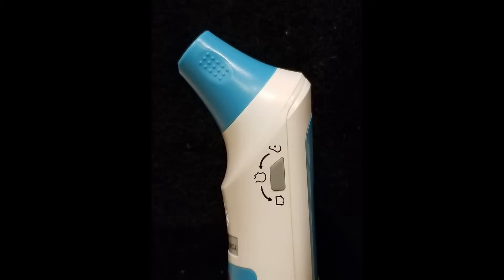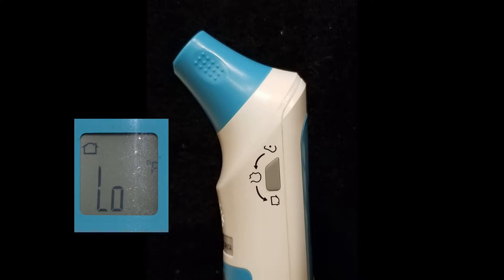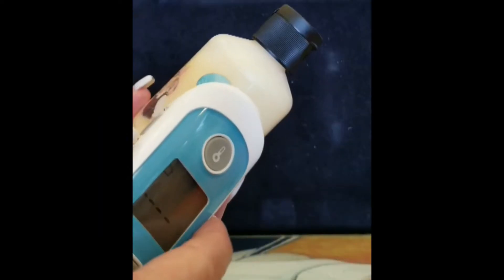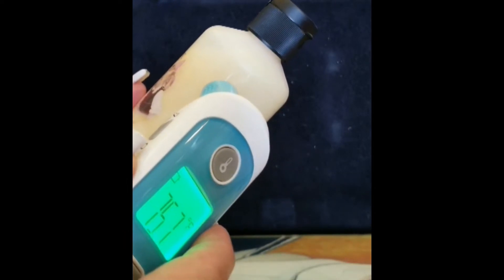Now if you want to take your temperature from your forehead, just put the cap back on — it snaps on very simply. Remember to press this button so you can see the forehead icon on the LED screen. Put this up to your forehead, press the button, and there it is — ninety-seven point seven. If you want to measure an object, press the button until you see the object icon on the LED screen, put it to the object, press the top button, and bingo.